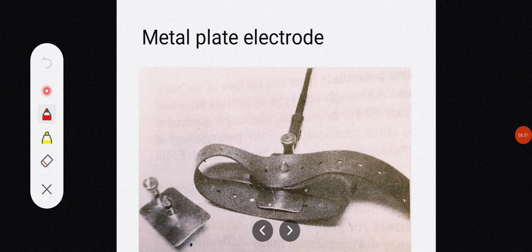Even the slightest movement changes the thickness of the thin film of electrolyte between metal and skin, and therefore causes changes in the electrode potential and impedance. In many cases the potential changes are so severe that they completely block the bioelectric potentials that the electrodes attempt to measure.